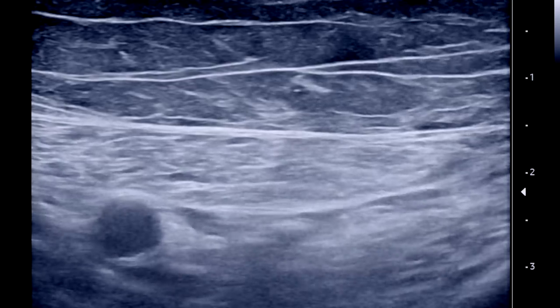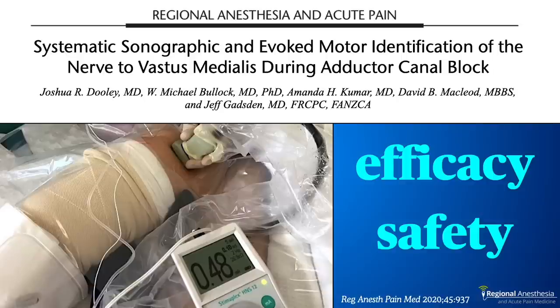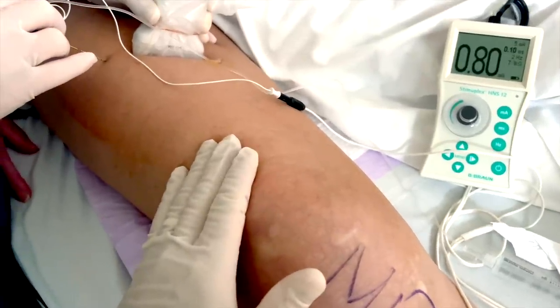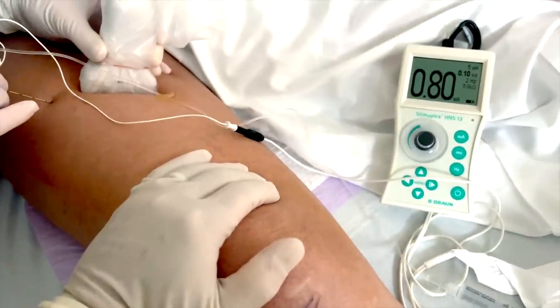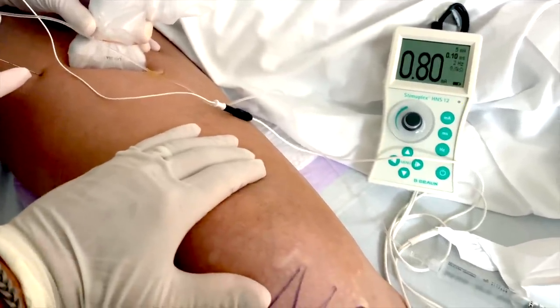The implication is that if you want to get both nerves, you can't simply put local next to the artery because that membrane is likely to prevent spread back along that fascial plane to the NVM. Since we can't see the nerve all that well but do want to block it separately, enter our old friend the nerve stimulator. If you stimulate as the needle is advancing through the fascial plane, as you get closer to the nerve, you'll suddenly evoke a motor response of the vastus medialis muscle. I keep my hand on the distal medial thigh as the trainee is advancing the needle and I'm instantly able to tell when the needle is close enough.